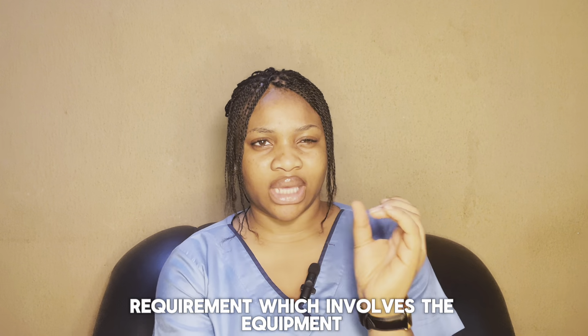So now let's talk about the equipment. The first one to know is the clean procedure tray. This is a food tray, but the procedure tray, that's what you need. That's the first step. You need non-sterile gloves, because this procedure is not a sterile procedure. It is a clean procedure. Even though it's not a sterile procedure, you need to follow and maintain aseptic non-touch technique.